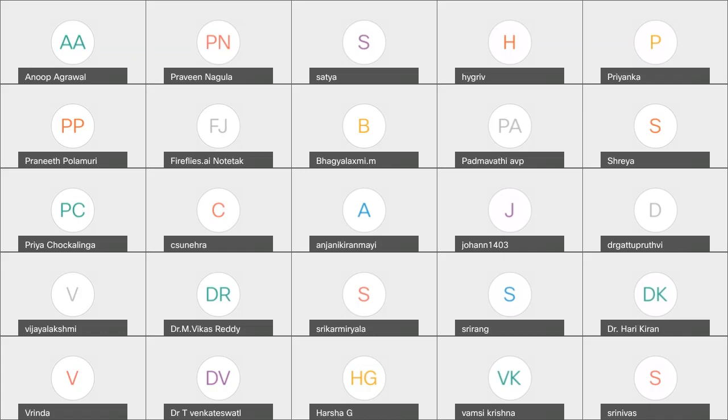And the MRI? So this was followed by a cardiac MRI. I'm sure Dr. Johann will give his inputs. So I'll again read the final diagnosis of the cardiac MRI. So it's an apical hypertrophic cardiomyopathy. The LV mass was 187 grams and the scar mass was 45 grams with a scar percentage of 24%. There is a patchy mid-myocardial delayed enhancement in the basal and mid-septum and apex, not conforming to any coronary artery.